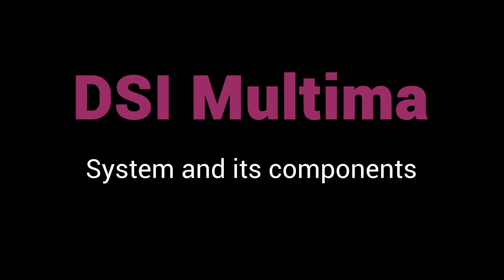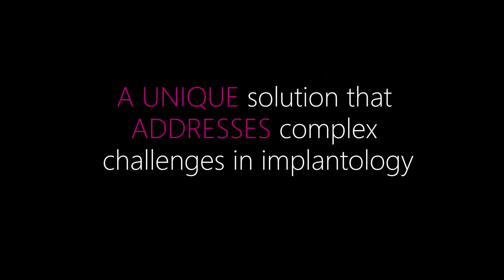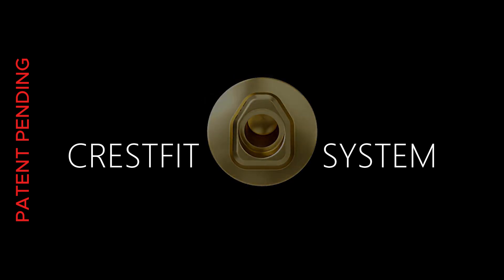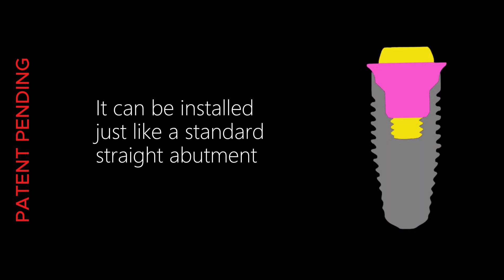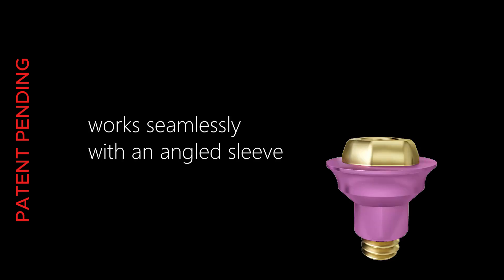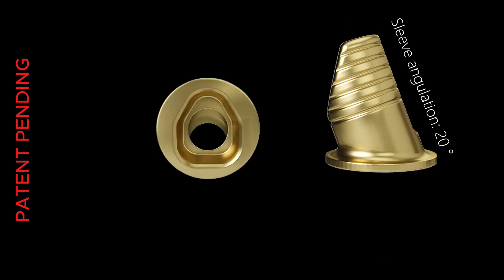Multima Dental introduces the Multima system and its components — a unique solution that addresses complex challenges in implantology. The CrestFit system can be installed just like a standard straight abutment, with no special tools or skills required. It works seamlessly with an angled sleeve set at a 20-degree inclination, offering significant prosthetic advantages.